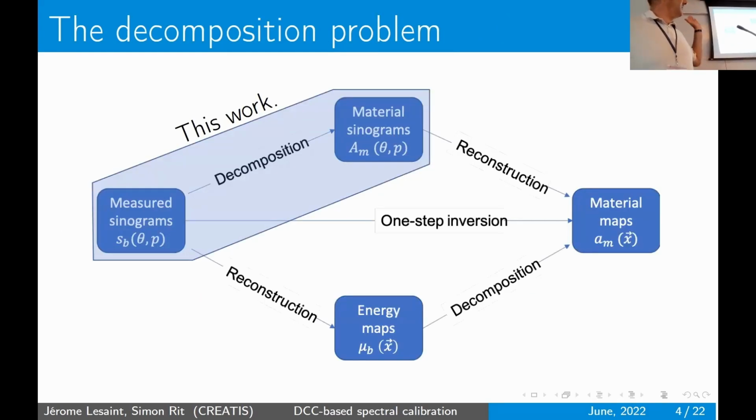So this work is clearly a projection-based two-step decomposition. What we want to achieve is to decompose our energy sinograms into material-specific sinograms, and the material basis we will be using in this work will be water and bone.